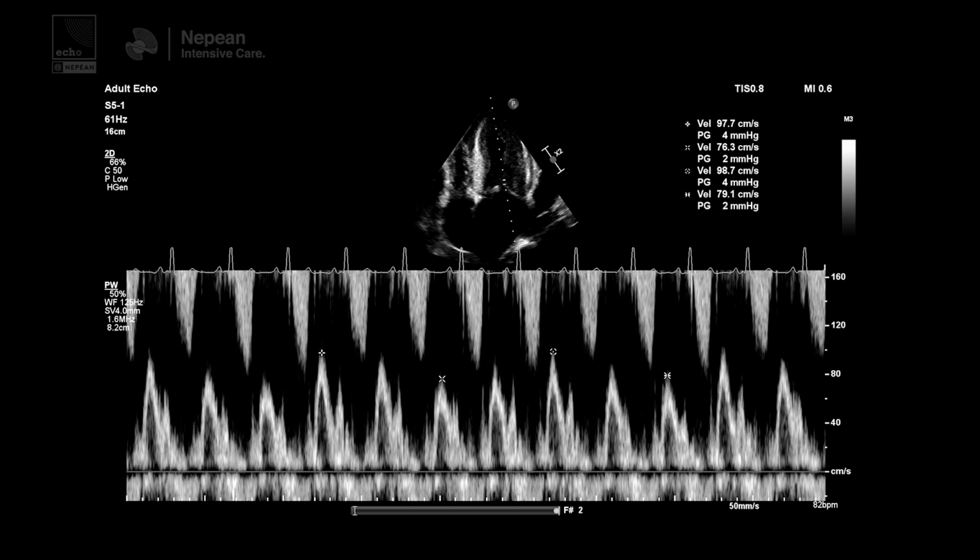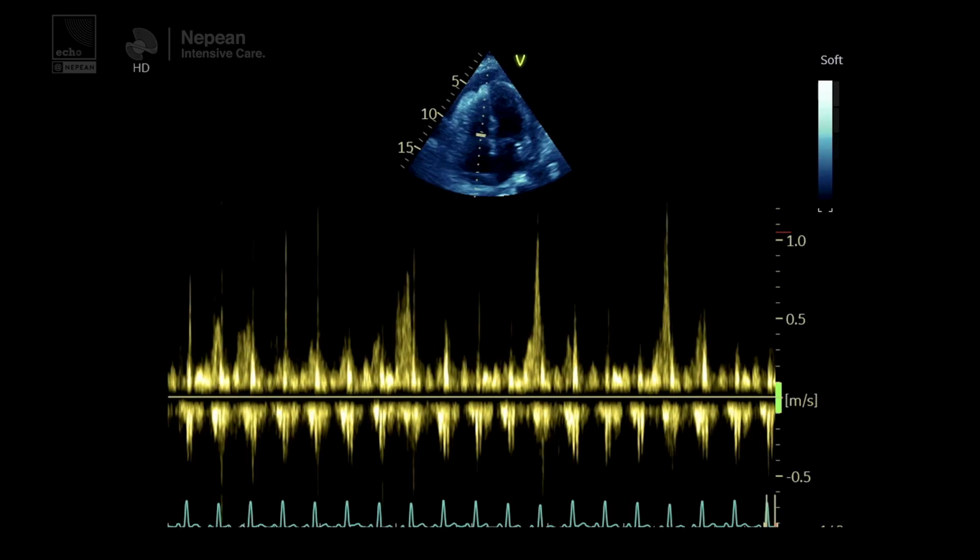Yeah. And then if you're looking at the tricuspid, you normally get slightly more variability, and on this view you can see that there's a really marked variability, and the quoted value is over 40% for being abnormal for the tricuspid valve. But there definitely are some caveats to this measurement, aren't there? Yeah, for sure. I think there's a lot of things you mentioned.